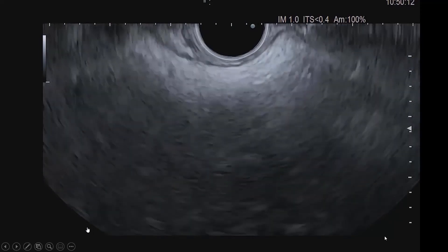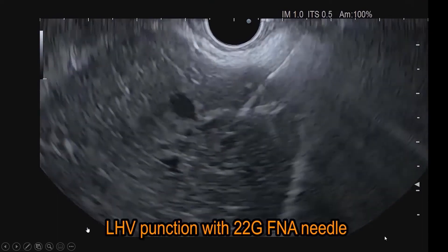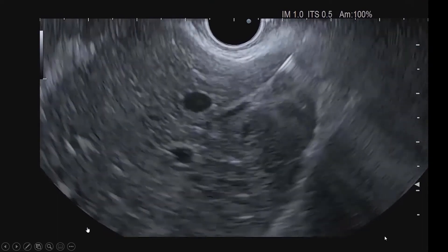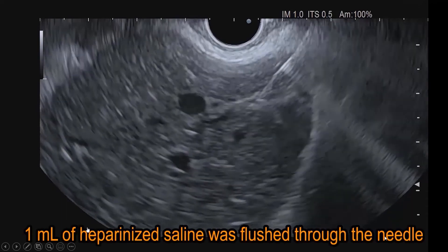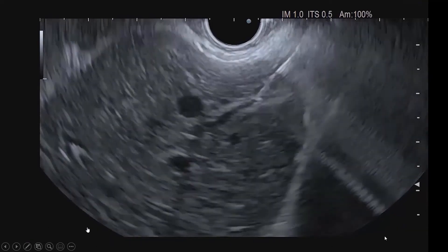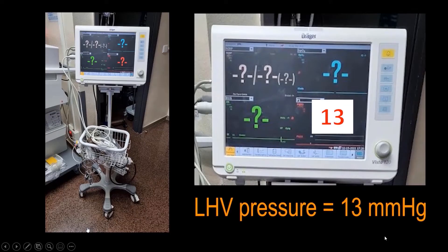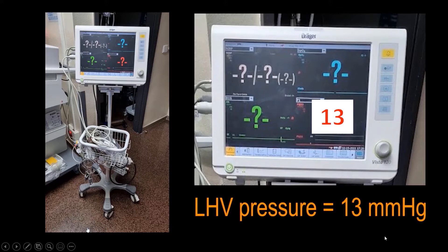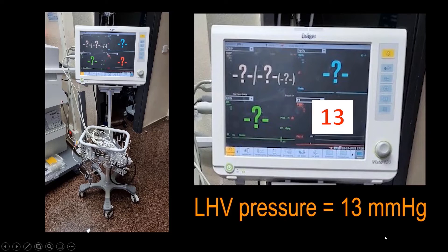Here you can see the puncture of the left hepatic vein. This puncture should be performed with a 22-gauge FNA needle. After the puncture, we should flush 1 ml of heparin-diluted saline through the needle, and while the heparin saline is flushing, we need to check the pressure monitor. In this case, the pressure of the left hepatic vein was 13 mmHg. Remember, you need to perform 3 different punctures in the left hepatic vein with 3 different measurements.